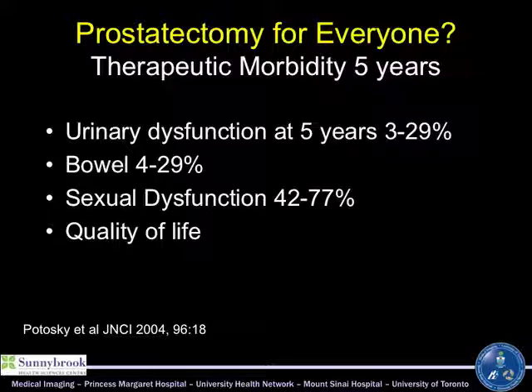So imaging, in terms of better diagnosis and localization, and the requirements for that, go hand in hand with the therapeutic approaches being advocated and put forward by the community. And this helps direct the quality of imaging, the performance measures in imaging that we want to achieve. I learned that it's important to keep that in mind. You need to design the instrument to work with the therapeutic approach being used in the community.